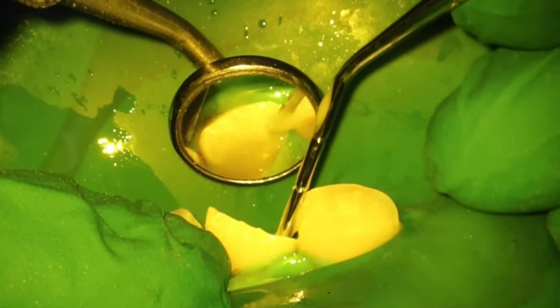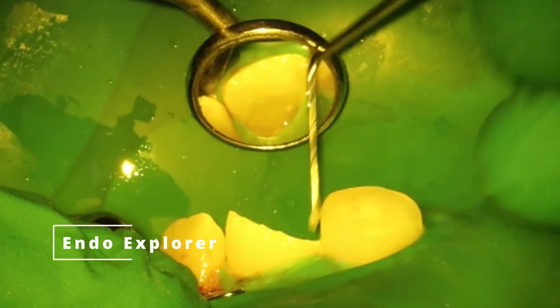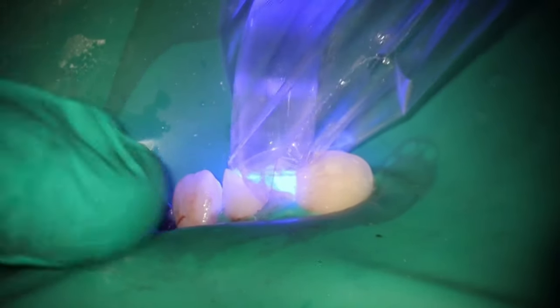I absolutely love it. Choose whatever your favorite unfilled glass ionomer is, because it has some innate dentin bonding ability, which is super cool. And what I'm doing here is I know that it doesn't bond to composite, so that's one of the issues with it. So I'm using the Endo Explorer and just a little air only here to remove it from the interproximal area, because like I said, I am going to be restoring this one as well. Go ahead and cure it like you normally would.